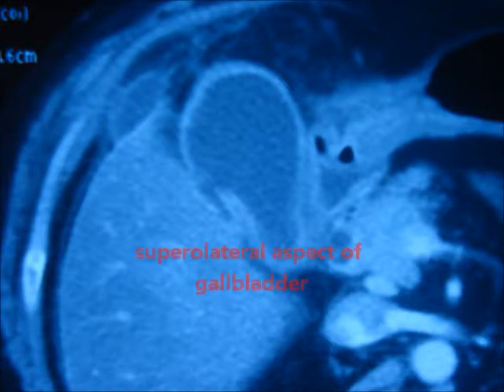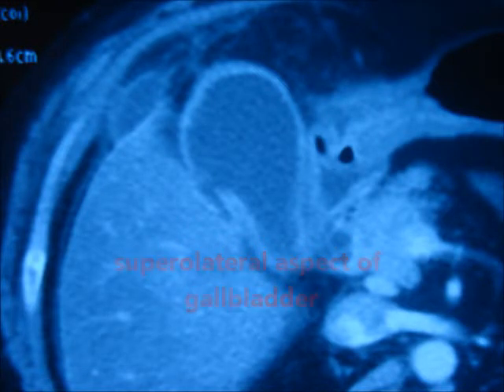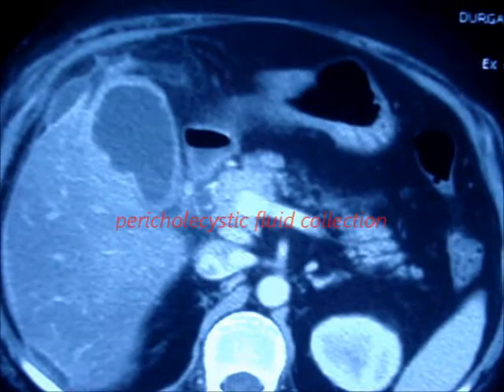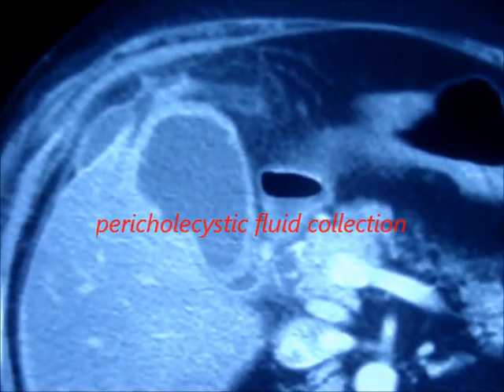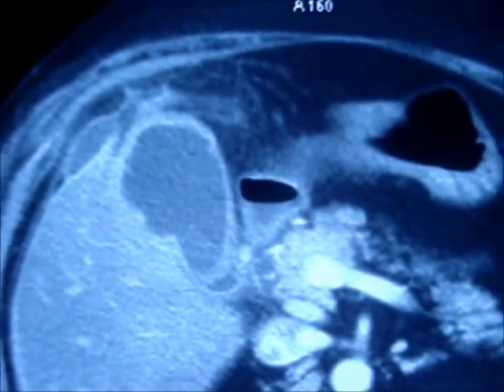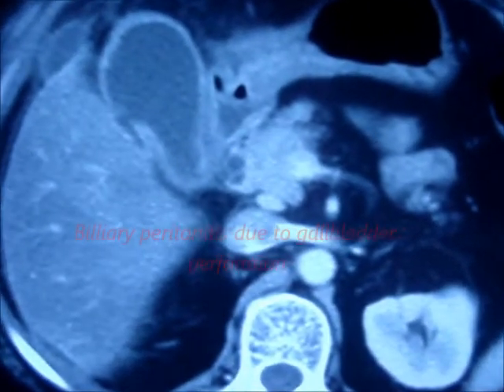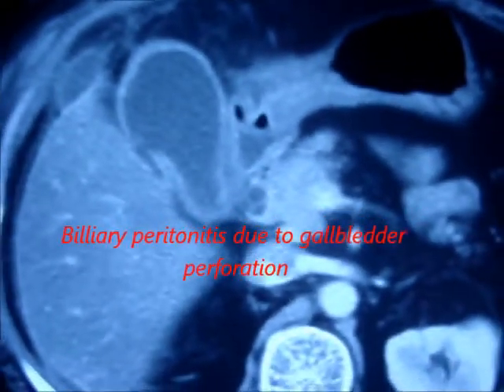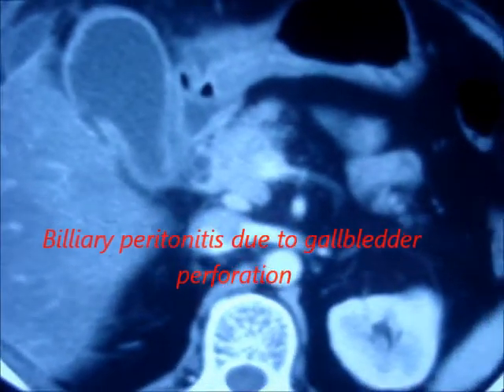This was diagnosed as gallbladder perforation with biliary peritonitis. This patient needs urgent surgical intervention. We performed diagnostic laparoscopy with laparoscopic cholecystectomy and thorough abdominal toileting.